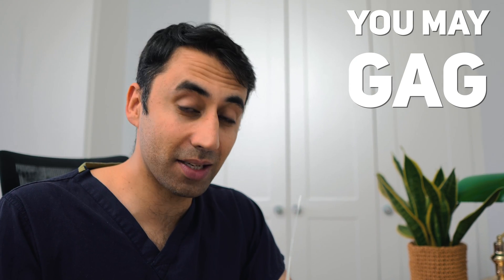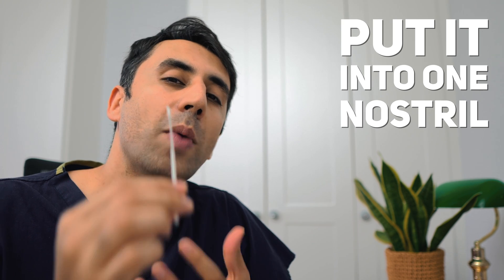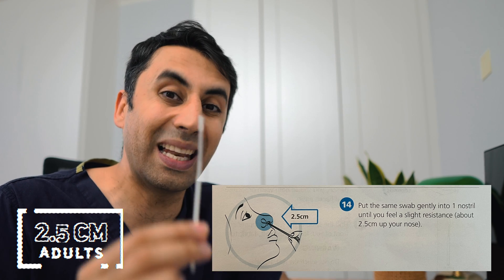You may gag — that's completely normal, just carry on. Then use the same swab, without touching anything else, to put it into one nostril. Tilt your head a little bit and go in until you feel a little bit of resistance. For adults it's about 2.5 centimetres up; for children, just go until you feel a little bit of resistance.